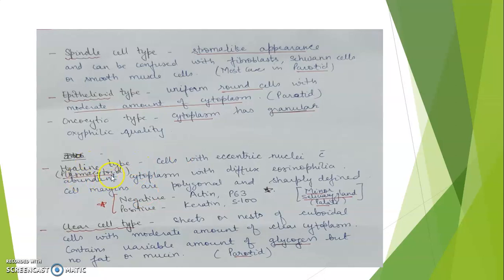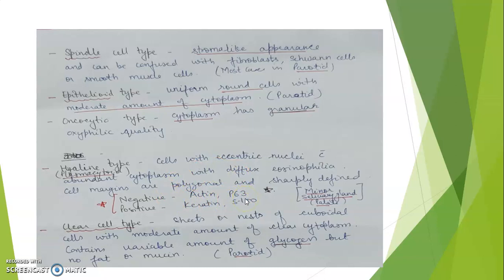The hyaline type or plasmacytoid type is common in minor salivary glands, particularly the palate. An important exception is that it is negative for actin and P63 — the myoepithelial markers present in other myoepitheliomas are negative in the hyaline type — while it is positive for keratin and S100.